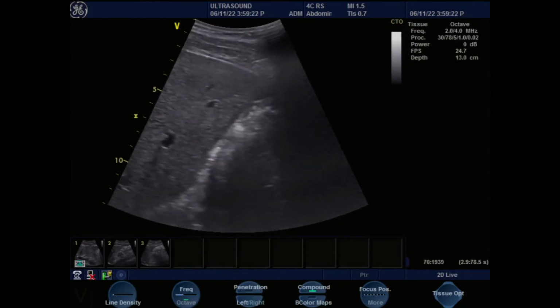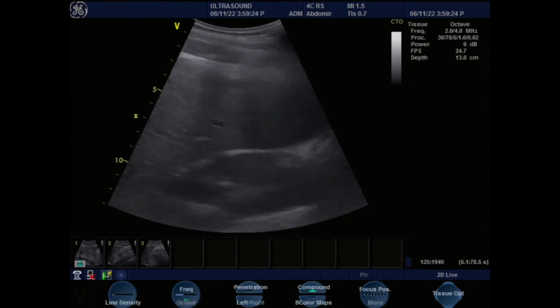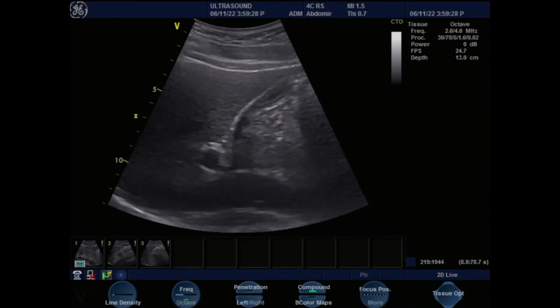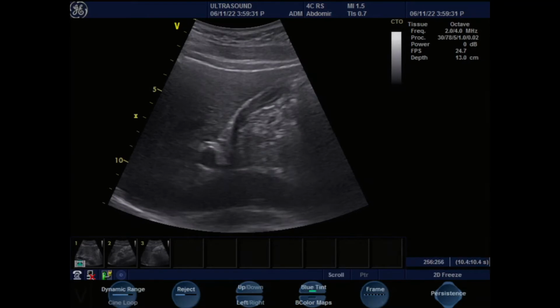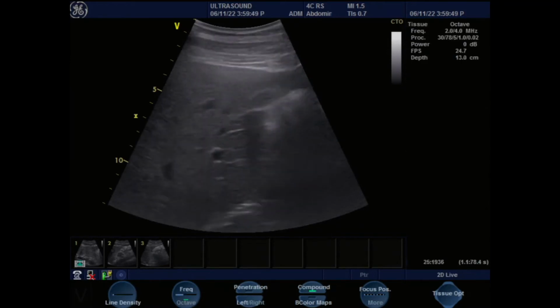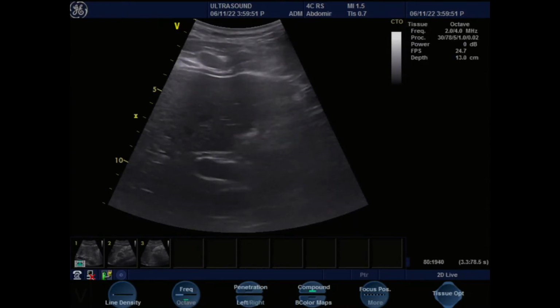So Hussain, take a deep breath, please. Hold it in. And there is the gallbladder neck again. Breathe, contracted. So neck here, and then for the vein, this dot is the hepatic artery, and this is where the CBD begins to stretch out. This is where my cursor is. I think this is a beautiful CBD there, stretching out here.